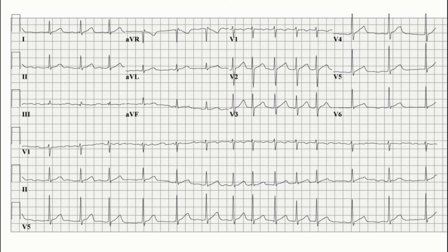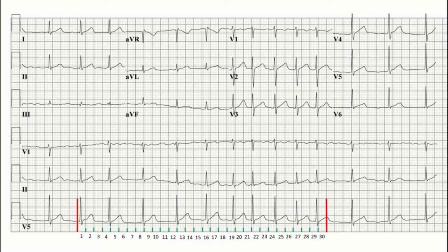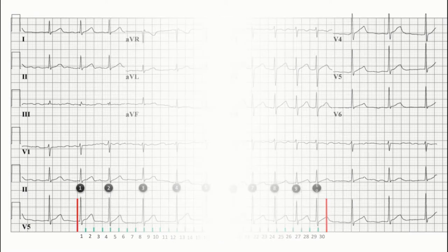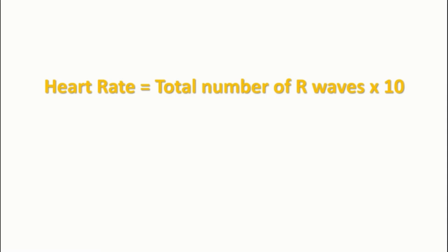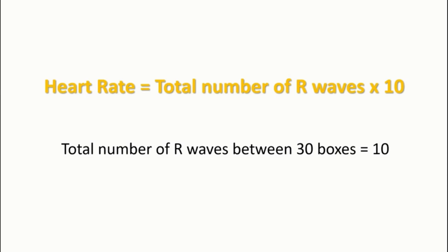There are 3 rhythm strips in this ECG and we can use any one of them as they have exactly the same timings for all events. First, we mark 30 boxes over one of the rhythm strips — we can start from any place. Now after marking the boxes, we count the total number of QRS complexes or simply R waves between our marked 30 boxes. We can see that there are 10 R waves between our 30 boxes. According to the 6-second rule, heart rate equals the total number of R waves between 30 large boxes multiplied by 10. In our case, the total R waves are 10, and hence the heart rate will be 100 beats per minute.